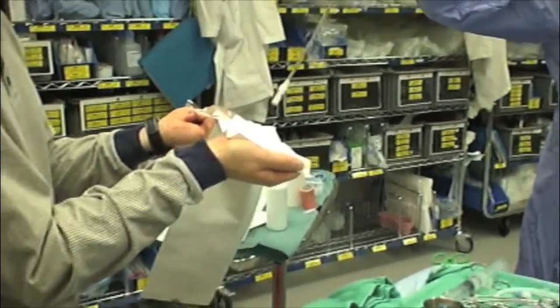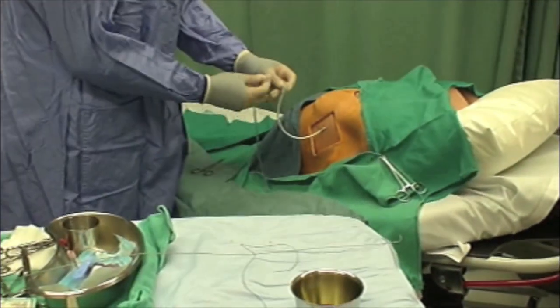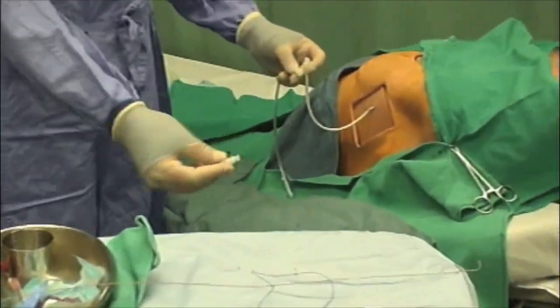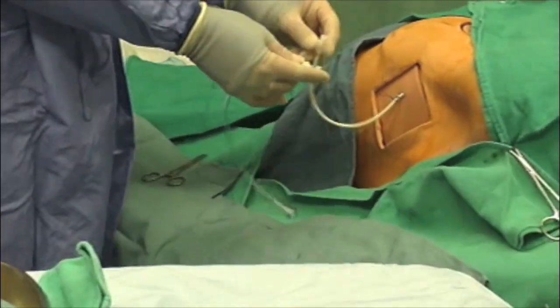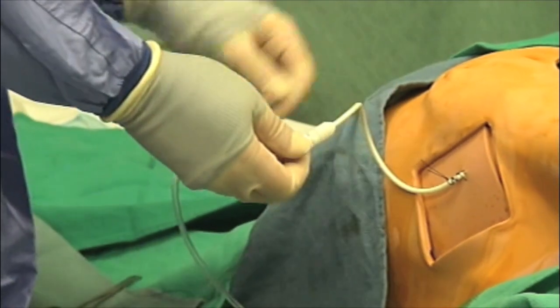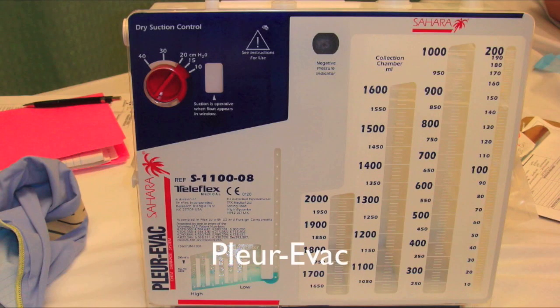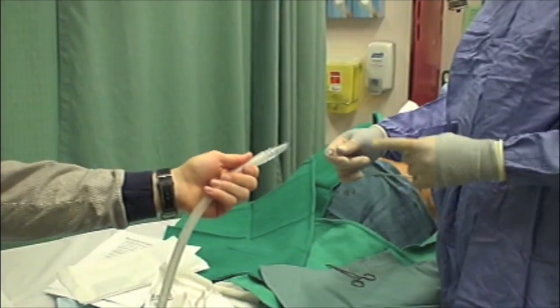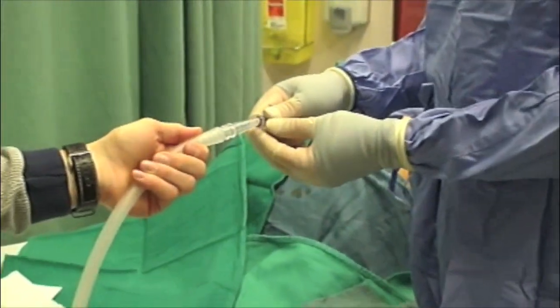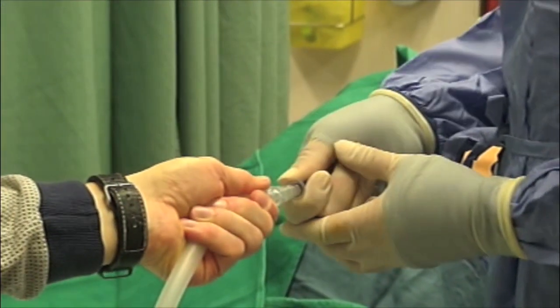Have an assistant open the connecting tube. Attach the connecting tube to the pigtail. Attach the connecting tube to an underwater seal apparatus, the Plurivac.